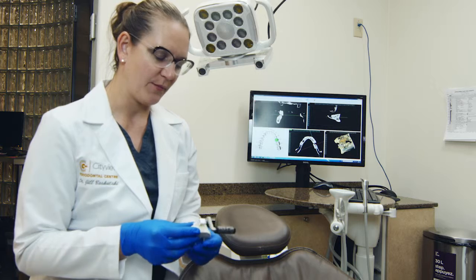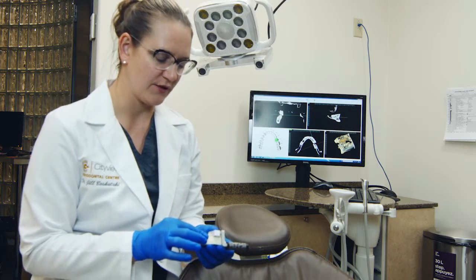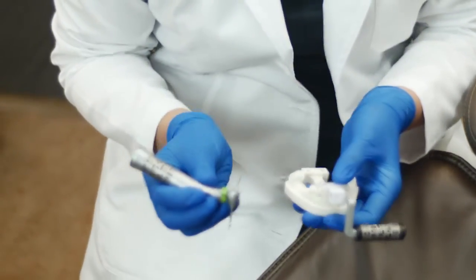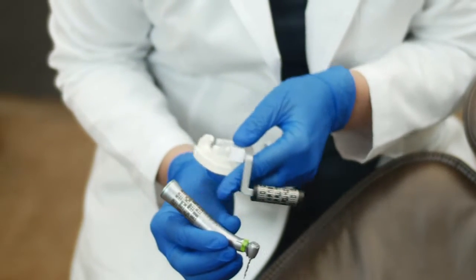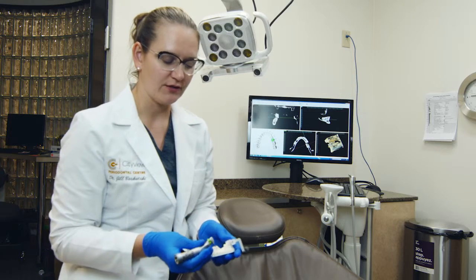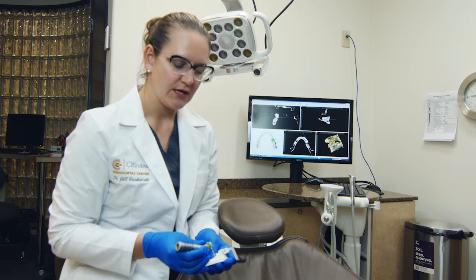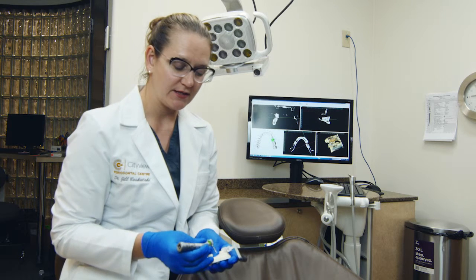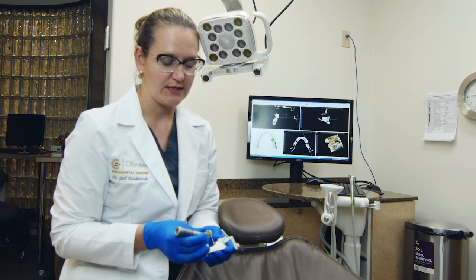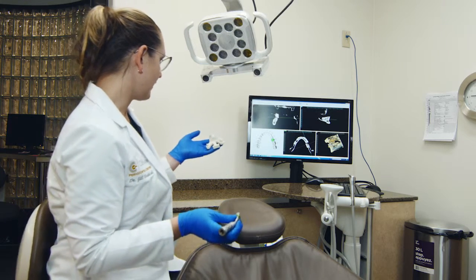So the patient wears the fiducial stent in the mouth during the implant surgery, and the other part of the system is a handpiece with markers on it that are also captured by the camera that's attached to the light. And so during the implant placement procedure, I have the ability to capture the exact position of my drill relative to the patient in 3 dimensions, which I can actually see on the screen behind me right here.